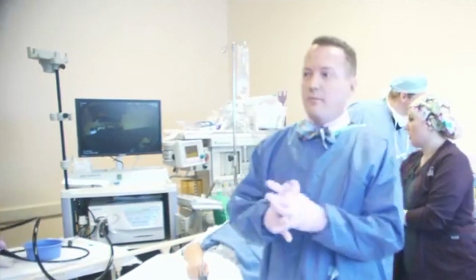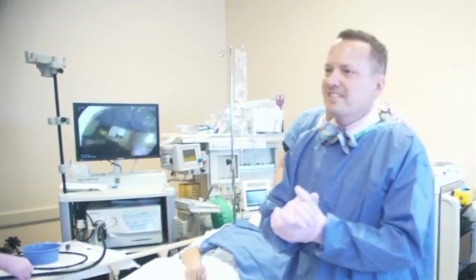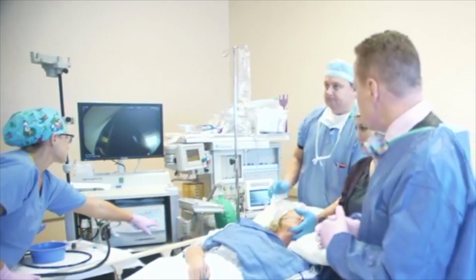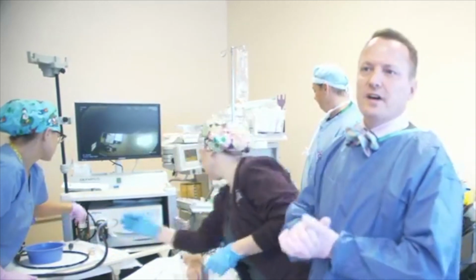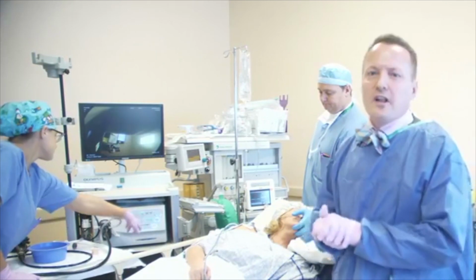Some other questions people may have. Have we had any questions yet from the crowd? So that sound she's making, is that hiccuping? Yeah, that's the hiccuping. Basically, the noise she's making is just like any hiccup. With the sedation, sometimes that induces that. So it's like any other normal hiccup.